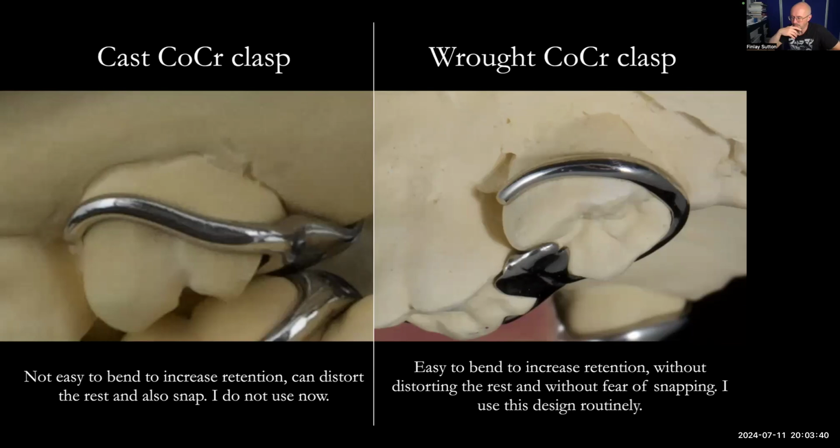And I found that throughout my whole working career. There's a lovely paper by Robert Willets, I think, from Newcastle, who did a literature review on this, opening the bite, and it showed there were no issues at all with patients' adaptation. But you could do it absolutely, and certainly if I was doing it for an exit fellowship case, Mustafa, going for an exam to present it as a final case, I would do it in the hospital. Say, look, we did this. But also, I would quote that paper too.